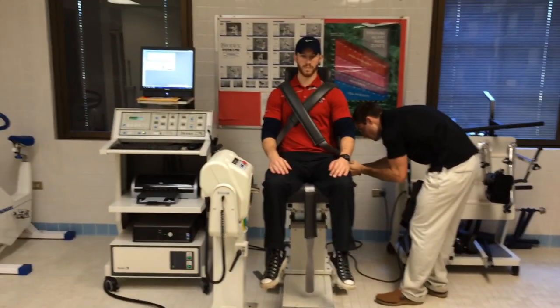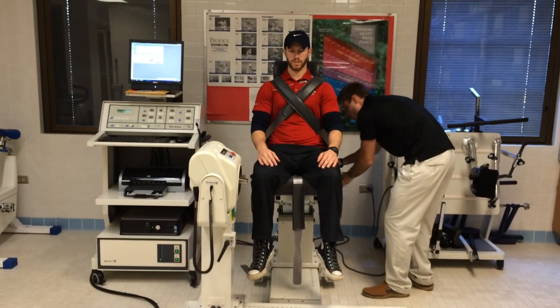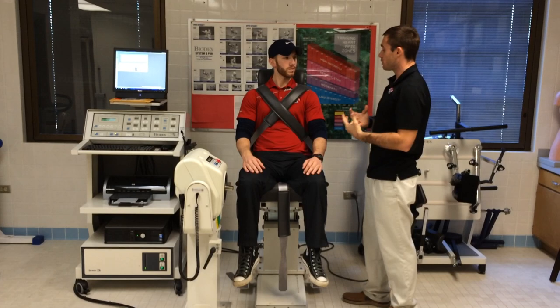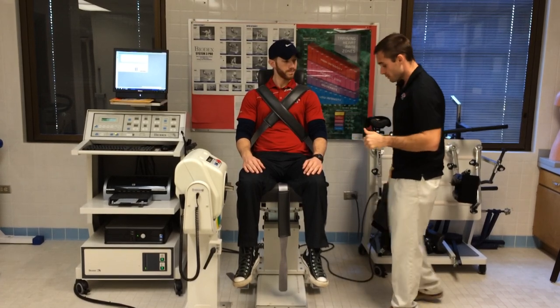On this side here. And then the first thing I'm going to do is ask, does that feel uncomfortable to you? I know it's tight, but it shouldn't be hurting you or anything like that. Is that okay? Okay, so he feels okay.